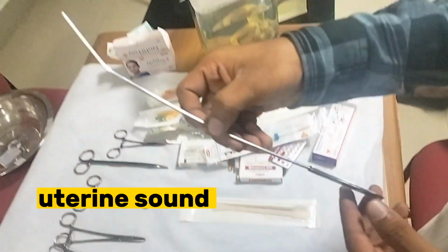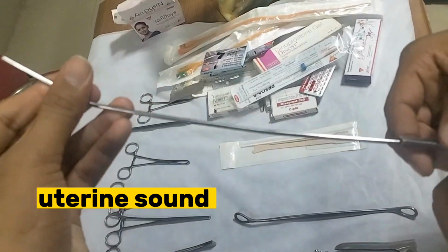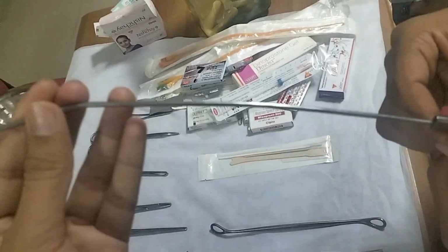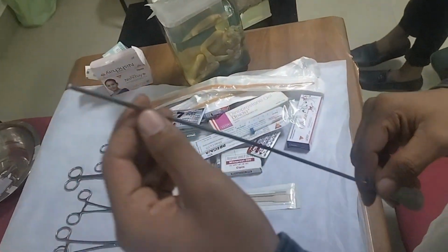Next, you can see this is a uterine sound. There are multiple gradings on the uterine sound. I hope you can see. This is used to know the retroversion or anteroversion of the uterus, and the contraindication is uterine perforation.